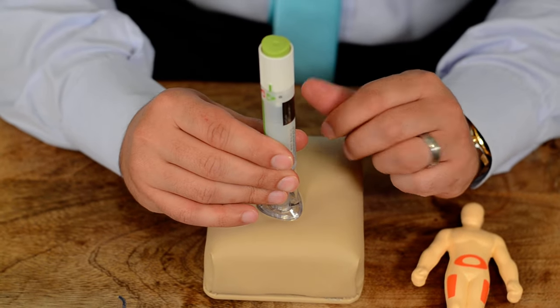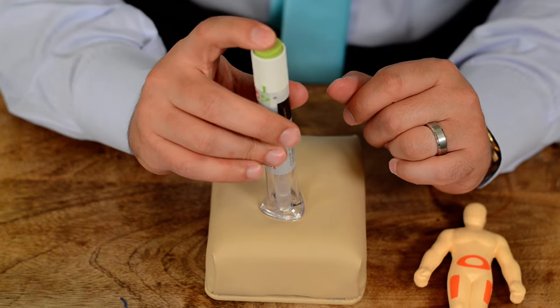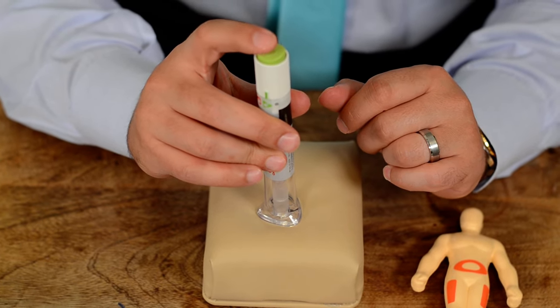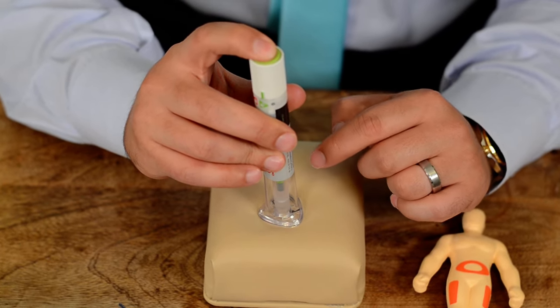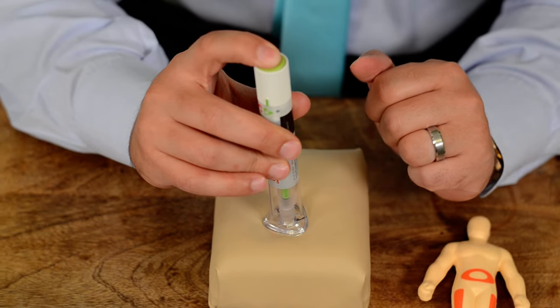That's step three, which includes pushing the plunger, because it's not going to do it itself. Push the plunger, now you watch it going in, five to seven seconds.